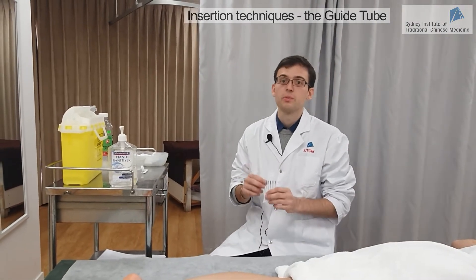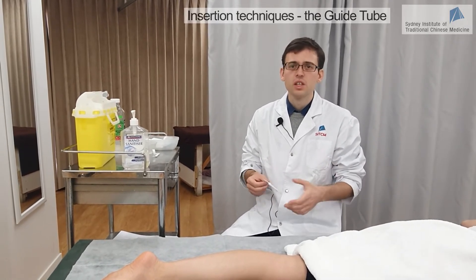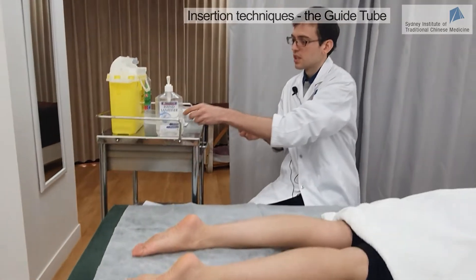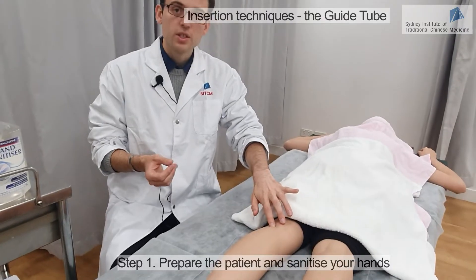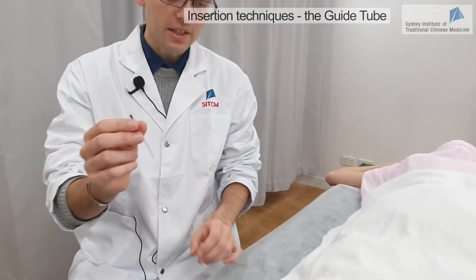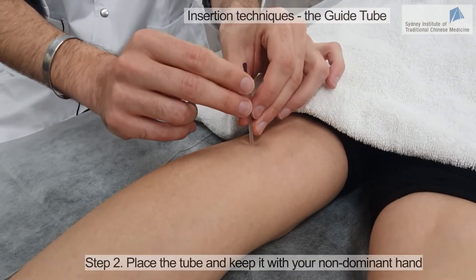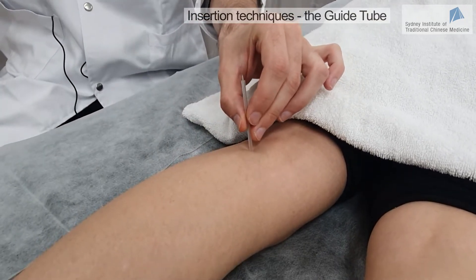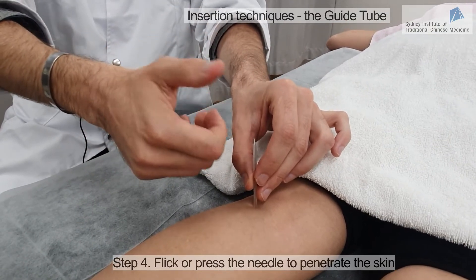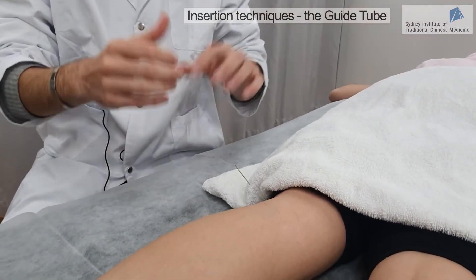I will now show you how to use the guide tube. Guide tubes are an excellent invention which helps us achieve painless insertion, and it's very easy, especially for beginners. If you don't feel comfortable inserting a needle, you can start with the tube and get more confidence. Today we're going to use it for Bladder 40. When you use the guide tube, you first leave the little plastic piece in place, find the point, keep it with your second hand, place the tube, and then remove the plastic piece. There are generally two ways of inserting the needle: you can either flick with your finger or press with your thumb. We'll press with the thumb — very quick, relatively painless.